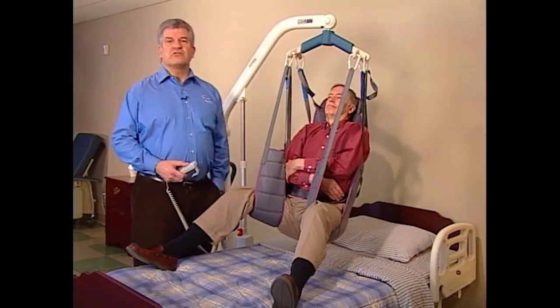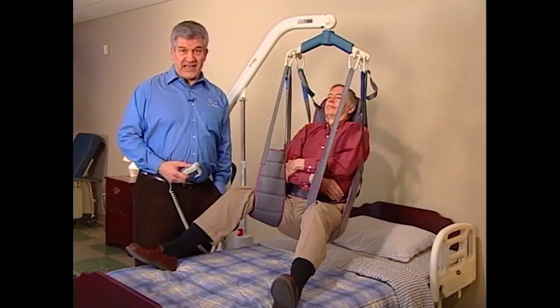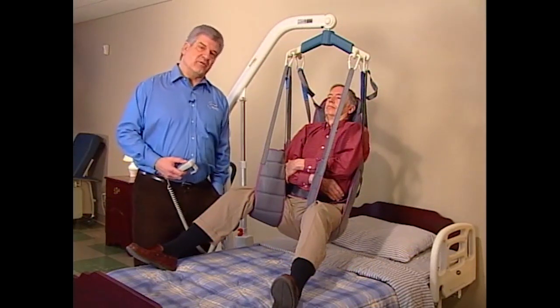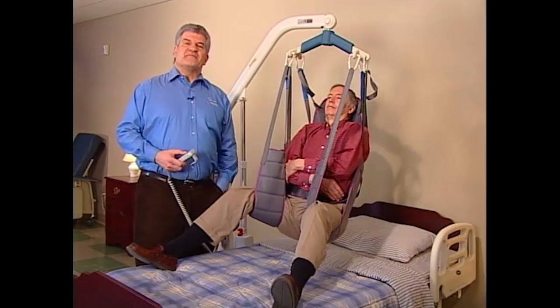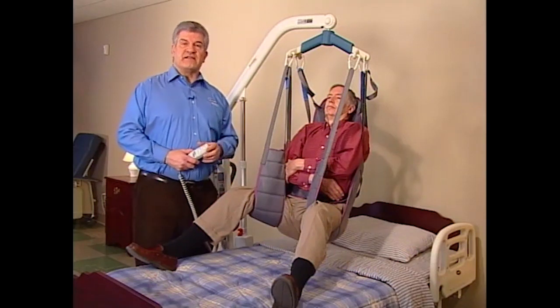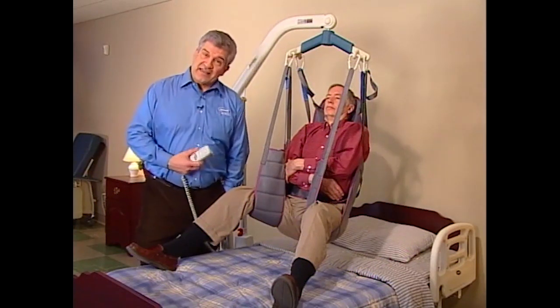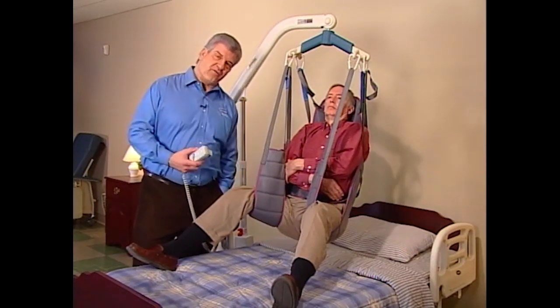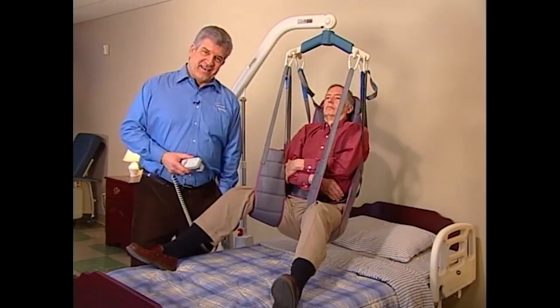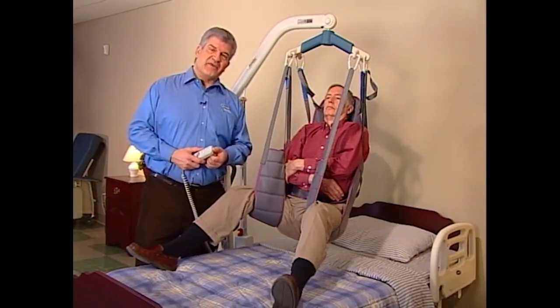Although one lift will work for most residents, it's recommended that each resident be issued their own individual sling that conforms to their weight, medical condition, and type of transfer that will be performed. Before you attempt any kind of lift, make sure that you understand the resident's limitations and their ability to assist with the transfer. It's a good idea to communicate with the resident throughout the process. Let them know about each step before you perform it so that the resident is comfortable, relaxed, and can help you in any way that they can.